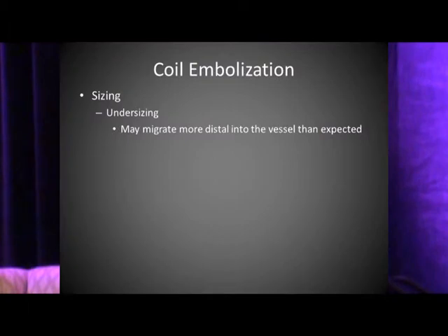Sizing of coil embolization is very important. You want to make sure that you have the right size. If you do choose too small a size, you can actually get a distal embolization. This is a case that I did early in fellowship. Patient was sent to us. You can see the clips there. He'd already been to endoscopy.